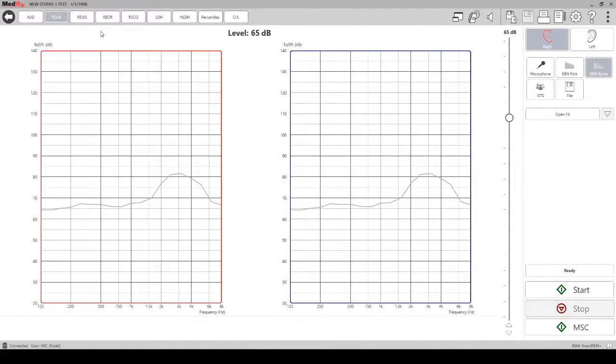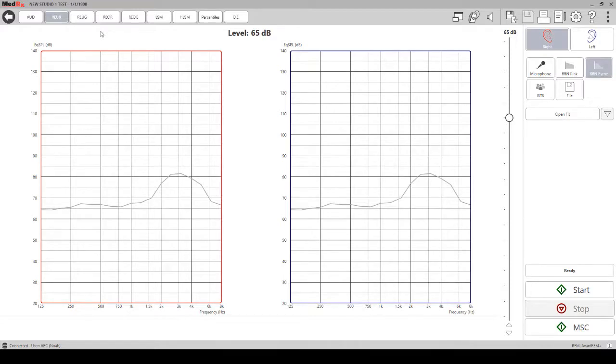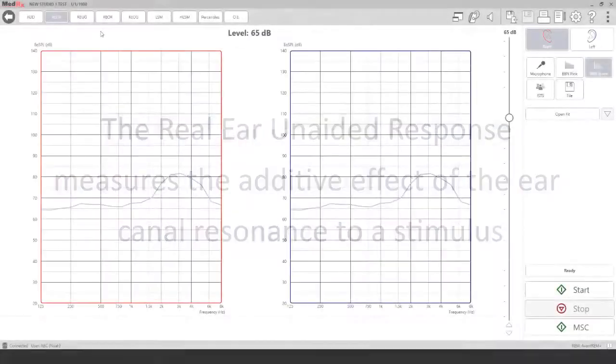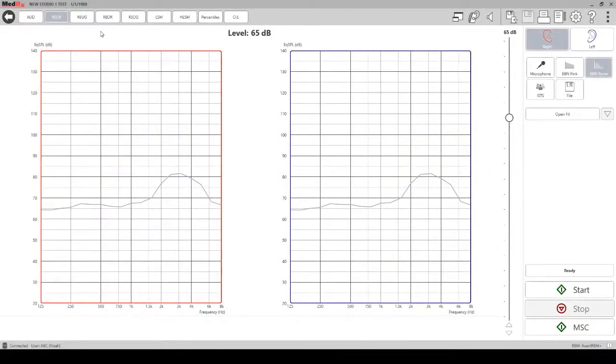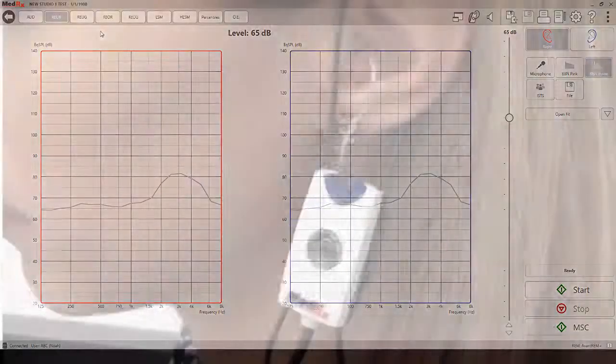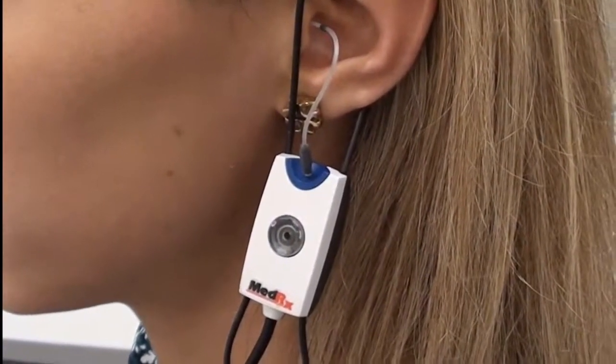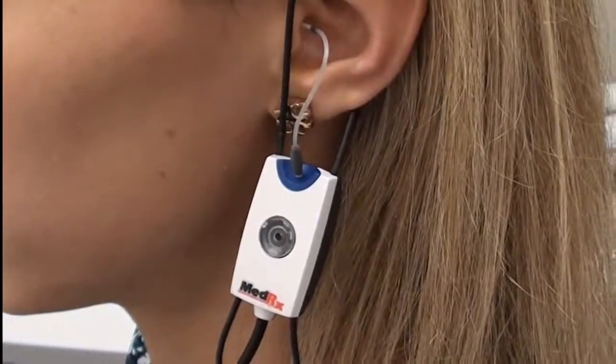If there is a dip in your measured REUR curve at six and eight thousand hertz, that typically indicates poor probe tube placement. The real ear unaided response measures the additive effect of the ear canal's resonance to a stimulus. When measuring the REUR, the probe tube is in the patient's ear without the hearing aid.